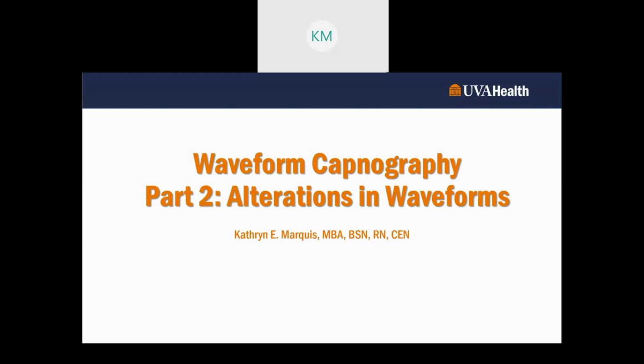My name is Kate Marquis, I'm a nurse here at Life Support Learning Center, and we're going to talk to you today about alterations in waveforms. This is a little bit more advanced than part one, the building blocks, and now we're going to talk about kind of weird things starting to happen here.